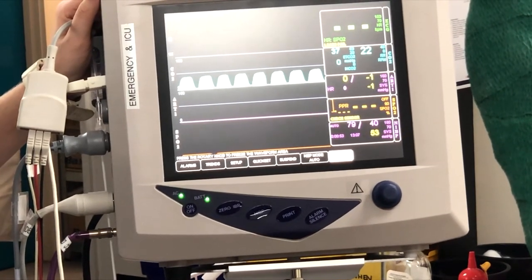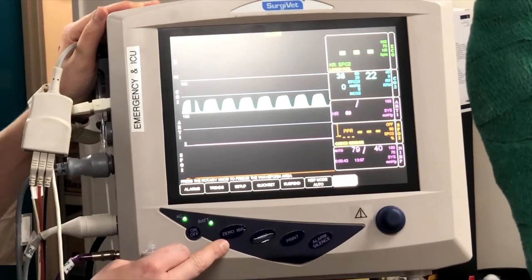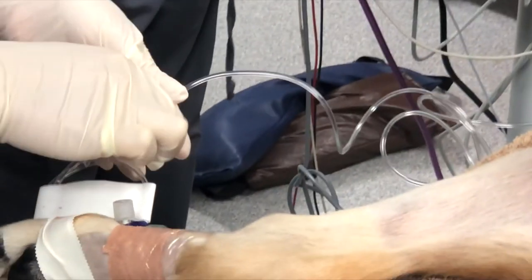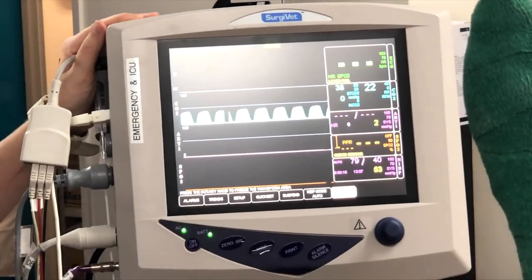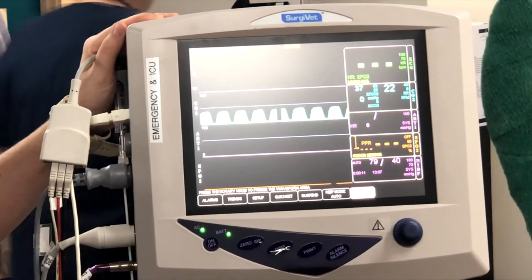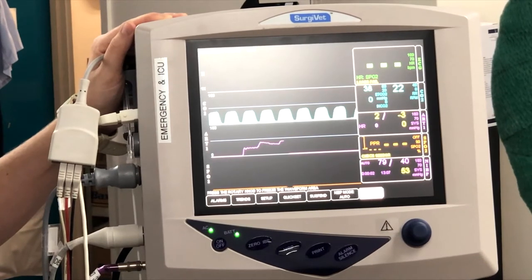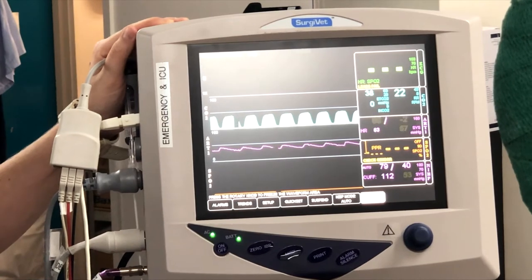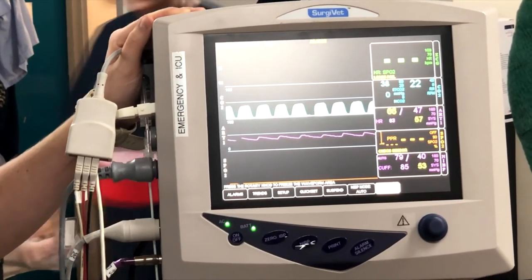We press zero IBP and wait for three zeros to come up — you might need to press it twice. Once zeroed, close it off to the outside world and reopen the system to the patient. There was actually a small kink in the tubing when we were filming, which gave us a rudimentary but significantly overdamped waveform.